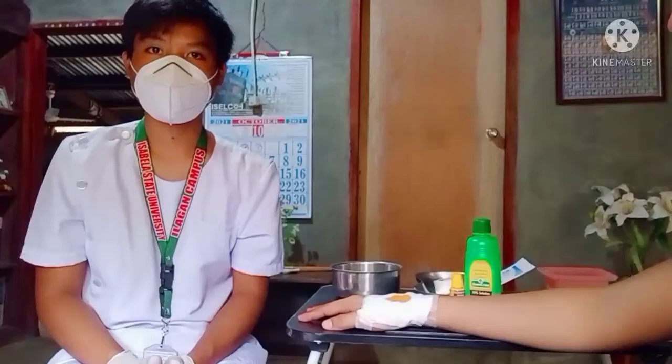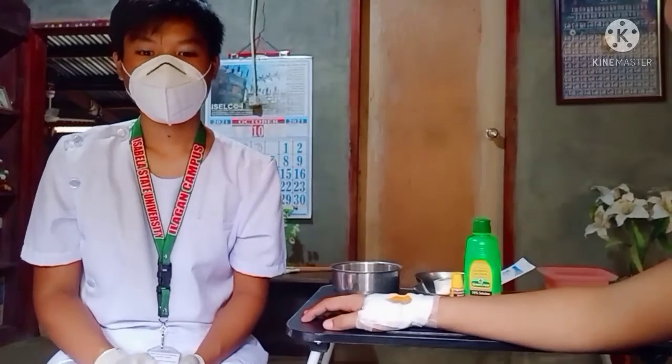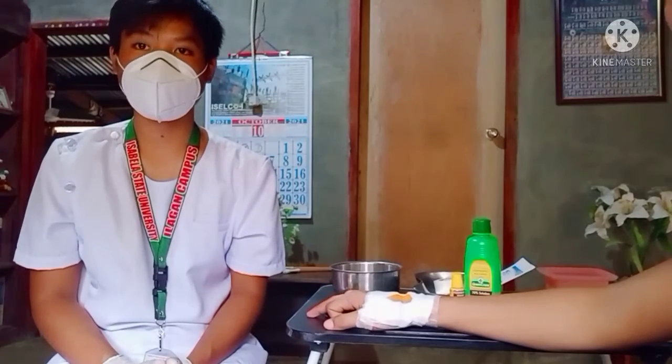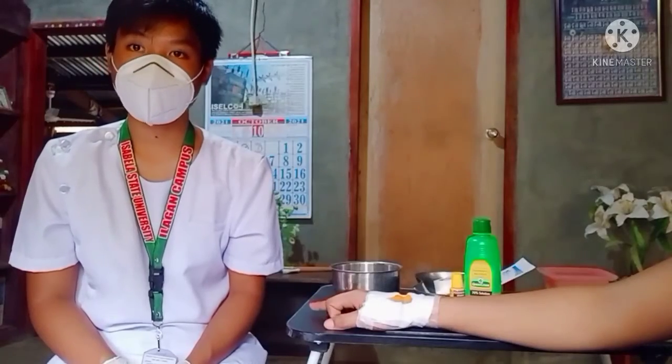Outer dressing so that the underside is away from the client's face. Place the soiled dressings in the moisture-proof bag without touching the outside of the bag to avoid the spread of microorganisms.